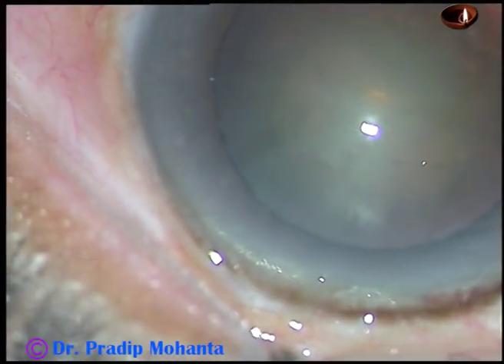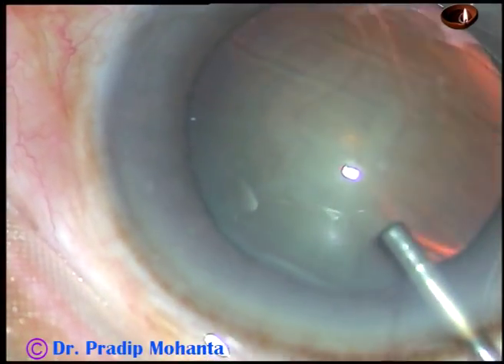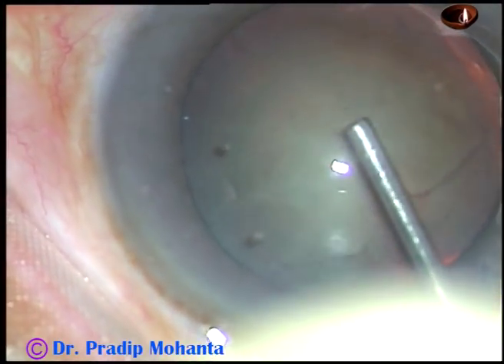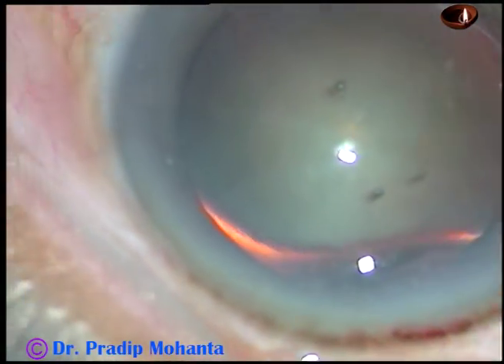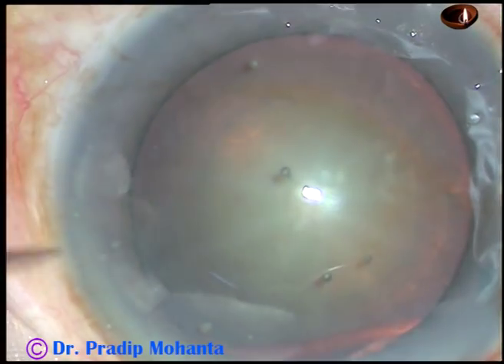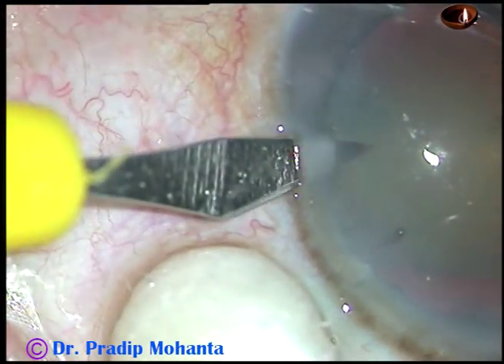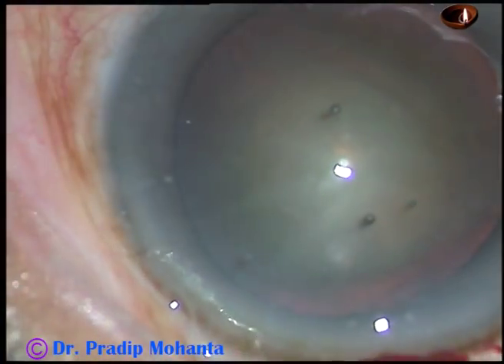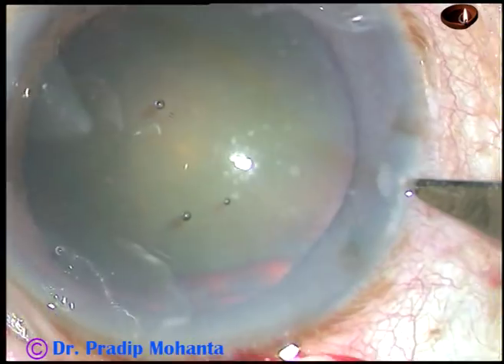By this time, the main incision has been made. This is 2% hydroxypropyl methylcellulose. It is used to fill the anterior chamber. And now I am going to make 2 side ports. This is the side port on the left side. My plan is to use bimanual irrigation aspiration in this case.